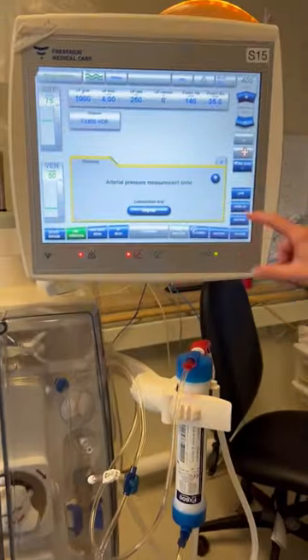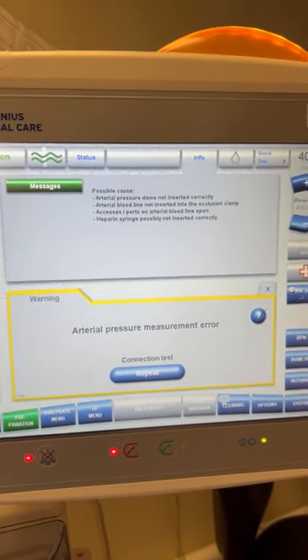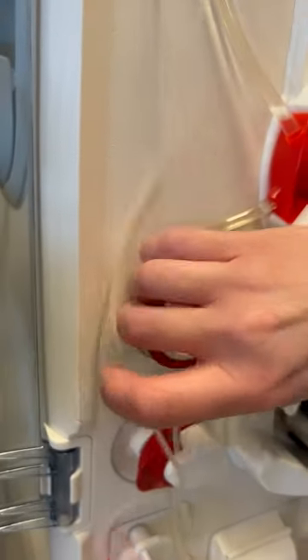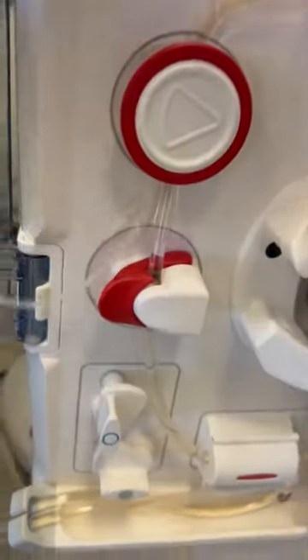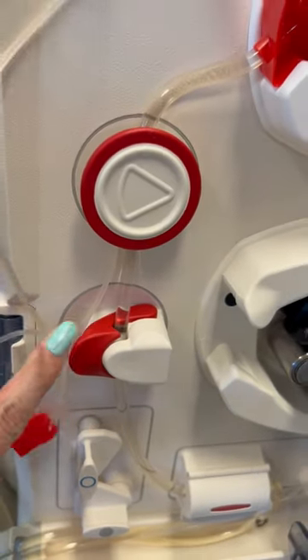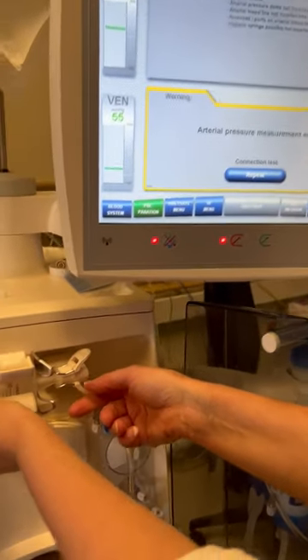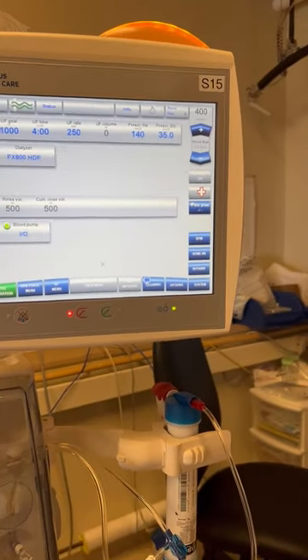This is a good opportunity for troubleshooting. Press the question mark to find out what the possible issues are. Arterial pressure dome not inserted correctly — the dome looks like it's in there as far as it can be. Arterial bloodline not inserted into the occlusion clamp — it looks like it is, but it might be a good idea to open and close it to see if it releases any pressure. Assess ports on arterial bloodline open — does it look like there's any leakage? Once we troubleshoot it, we'll repeat the connection test.